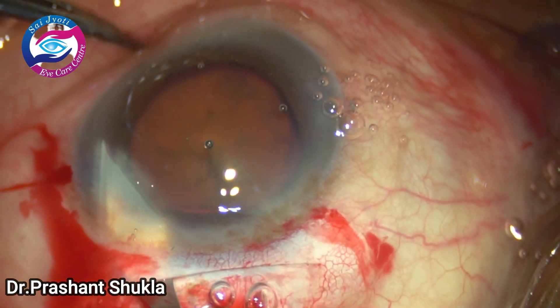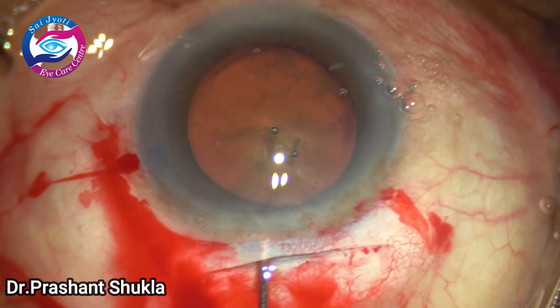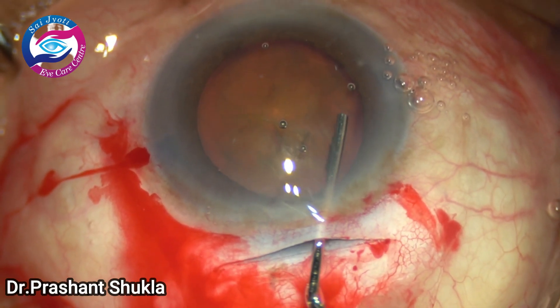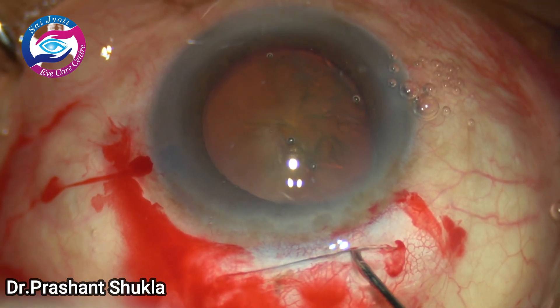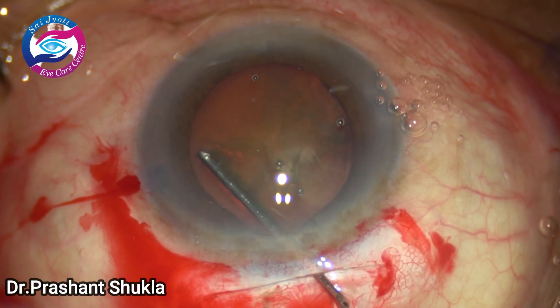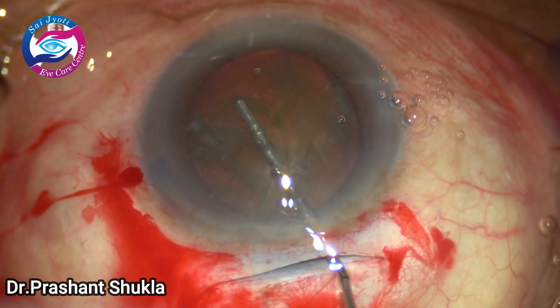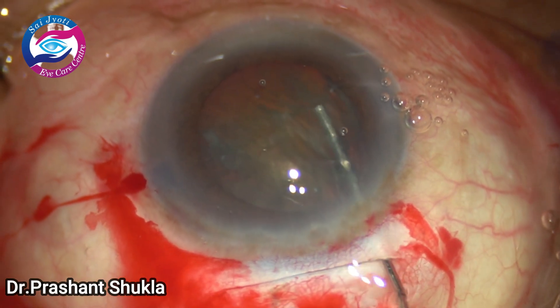Now it is time to do hydrodissection to remove the cortico-capsular adhesions. The 27-gauge cannula is slid under the anterior capsular margin, the capsular margin is slightly lifted, and a small bolus of fluid is injected. The nucleus is then nudged so as to release any entrapped fluid that is posterior to the nucleus.